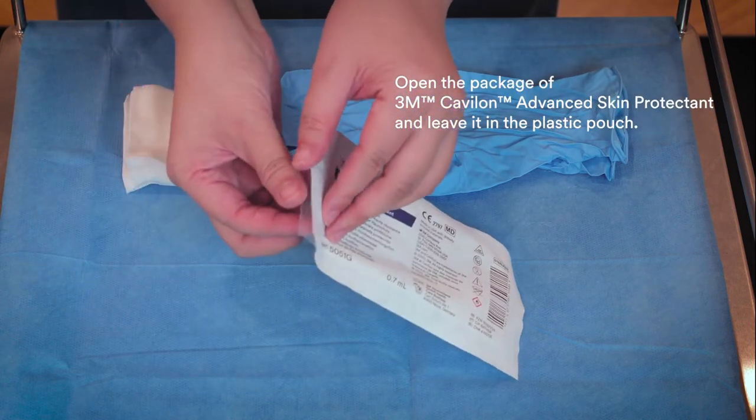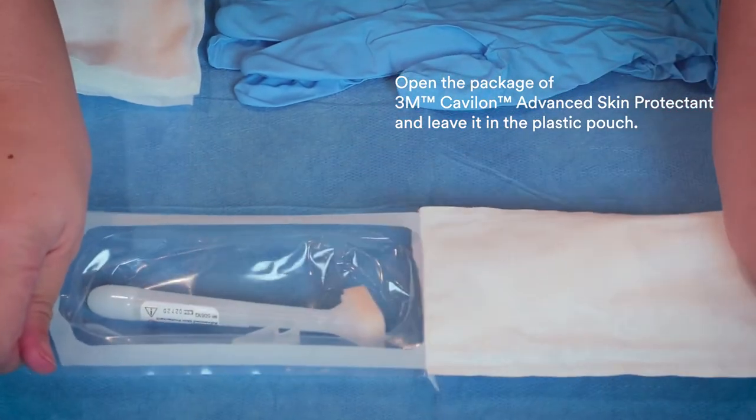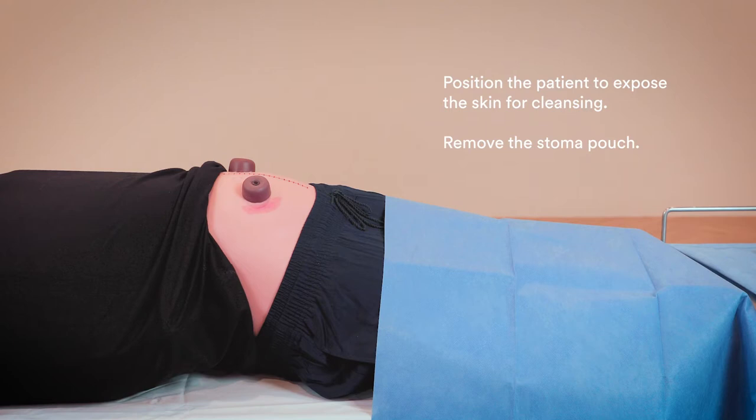Open the package of 3M Cavilon Advanced Skin Protectant and leave it in the plastic pouch. Position the patient to expose the skin for cleansing. Remove the stoma pouch.